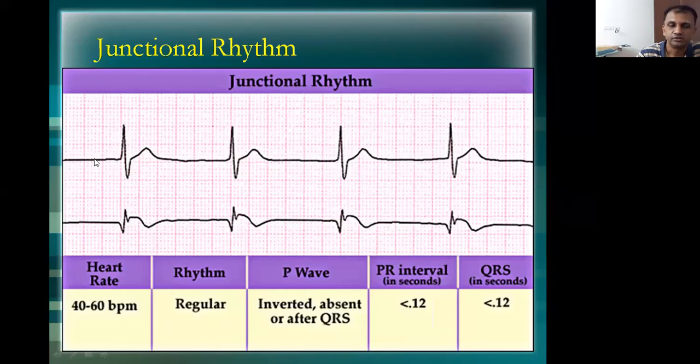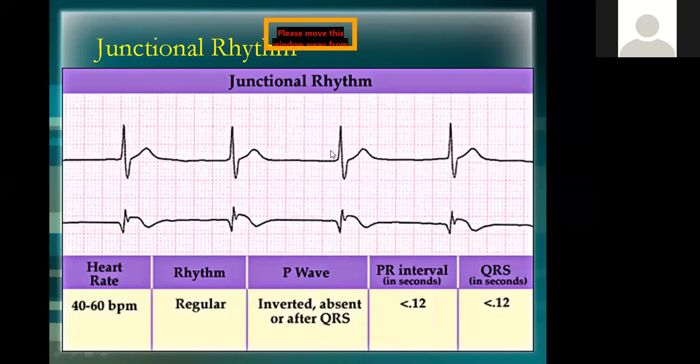In this one, can anybody pick up anything in this ECG apart from the one I mentioned? Hello, are you guys listening? Hello. Yes, sir. Can you see the P wave? No, sir. Missing.